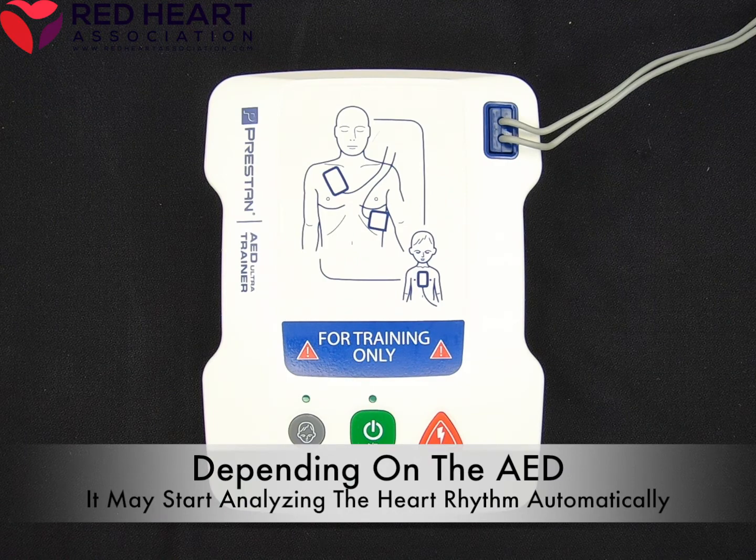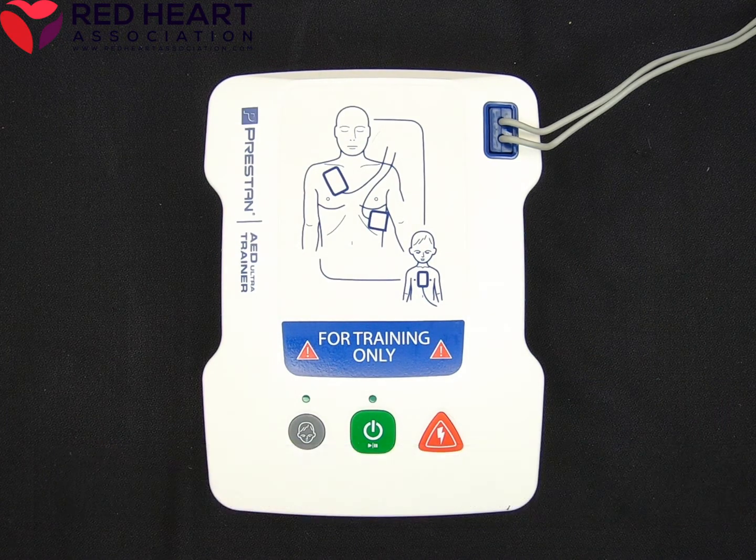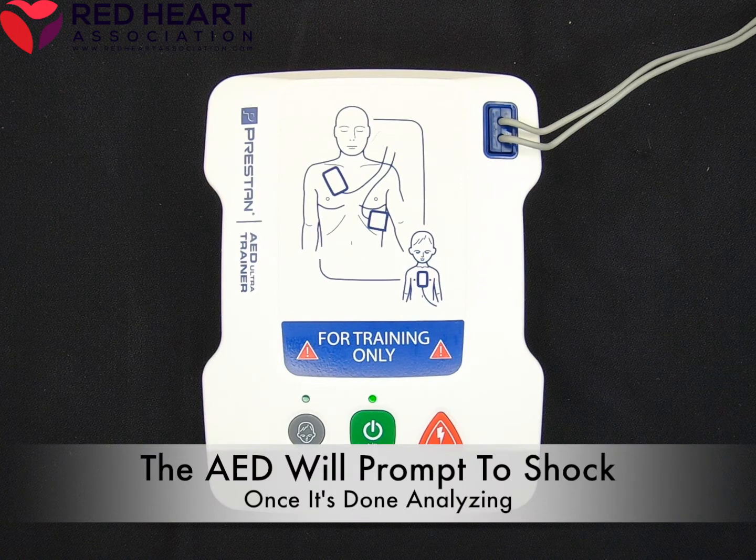Depending on the AED being used, it may start analyzing the heart rhythm automatically. If not, press the button to prompt it to begin analysis. Once done analyzing, the AED will prompt if a shock should be delivered.